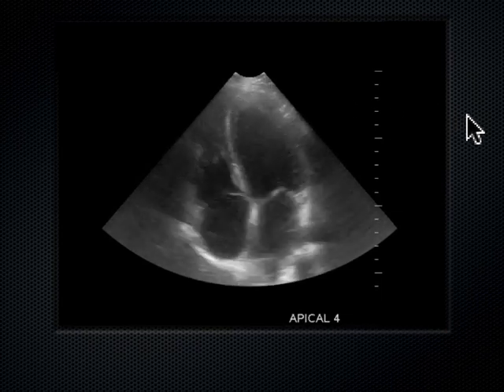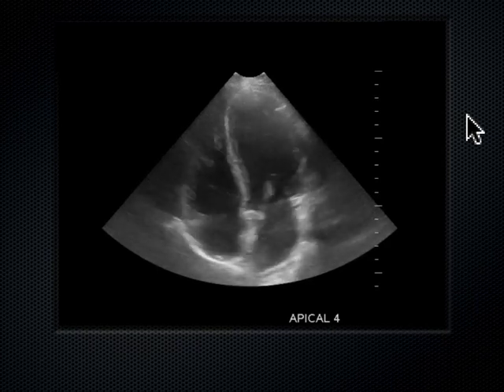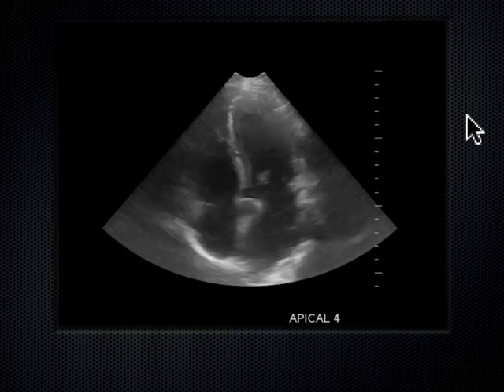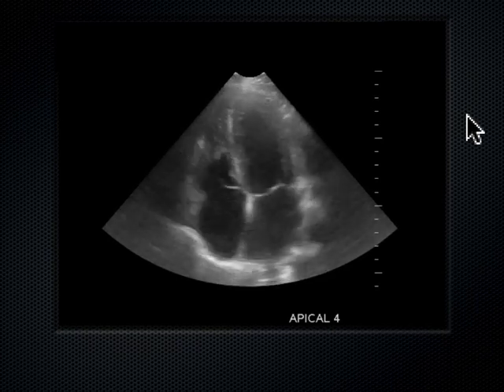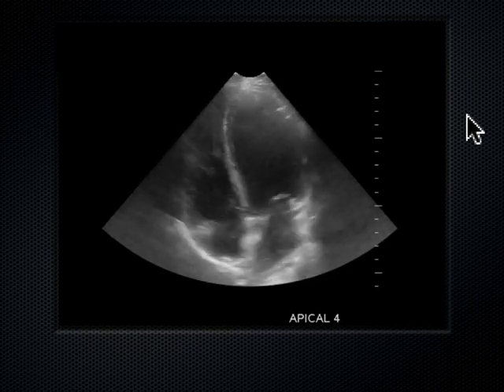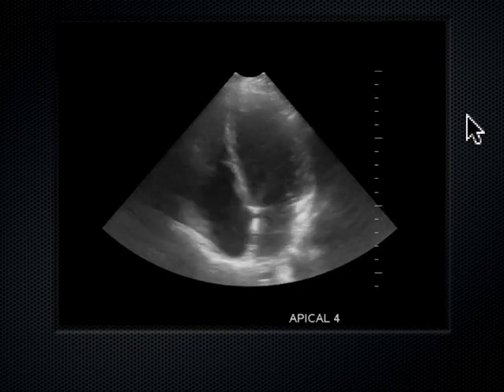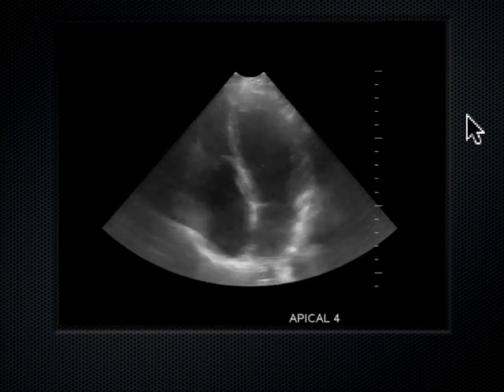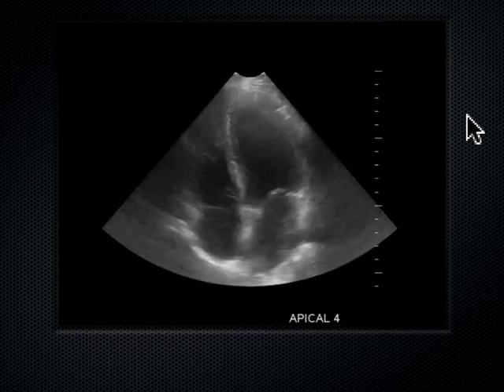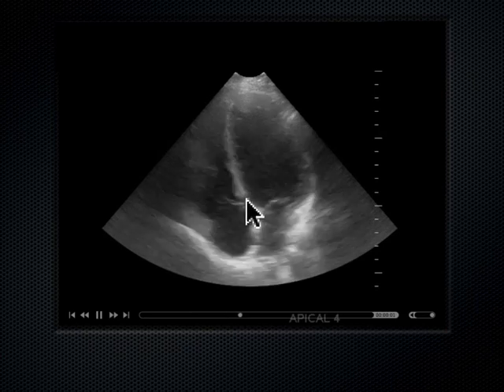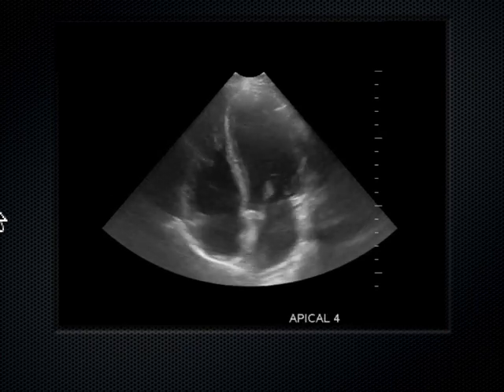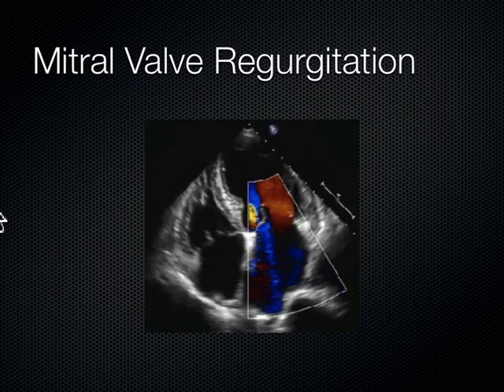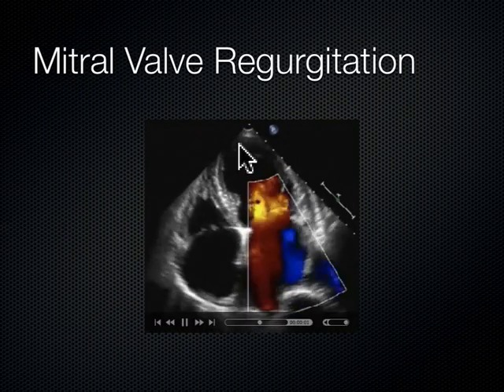In the models upstairs, pretty much all of them have decent apical four chambers — last Tuesday we had one person struggle. Notice once in a while we see that aortic valve pop in there. Let's go ahead and throw some color across that mitral valve.